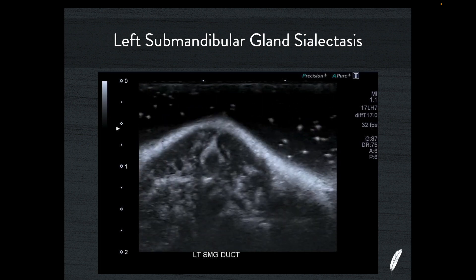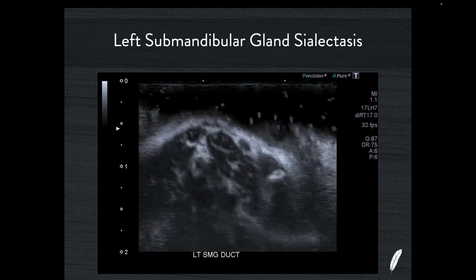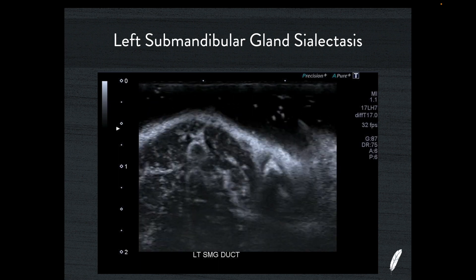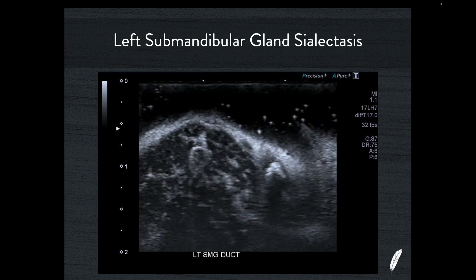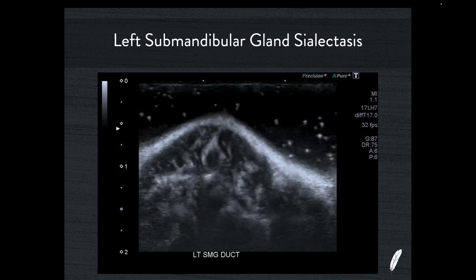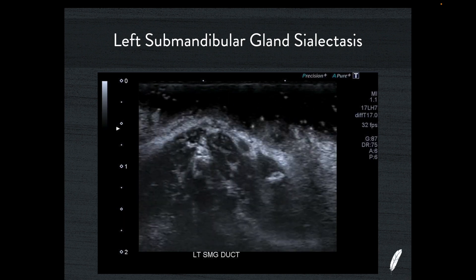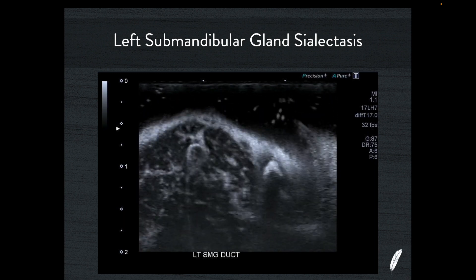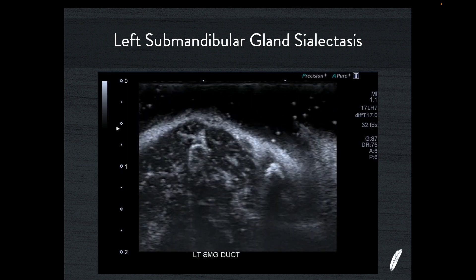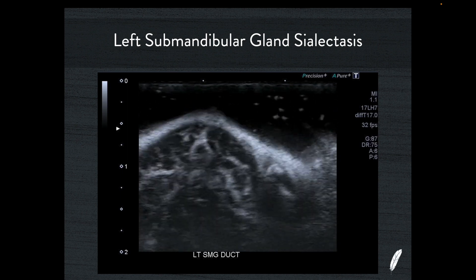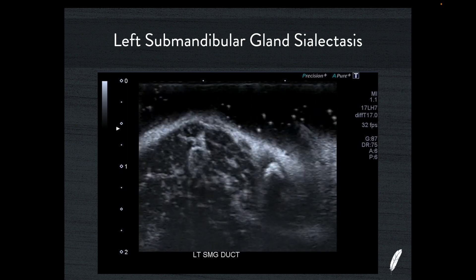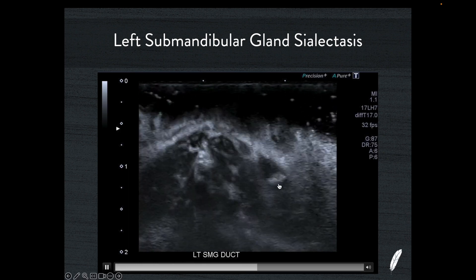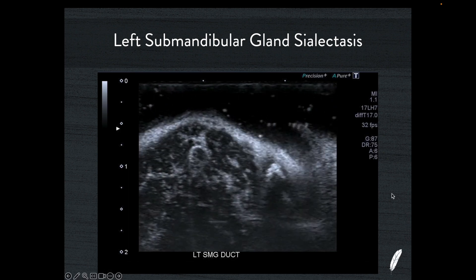I then take a hockey stick transducer — in this case the 17LH7 — which fits perfectly in the oral cavity. Very carefully, I place this transducer inside the mouth, perched across the frenulum of the tongue in a transverse plane, then scan anteriorly and posteriorly slightly until I find the ampulla of Wharton's duct. Once I find the ampulla, you can see there's a calculus lodged in it — and that's given me the answer.